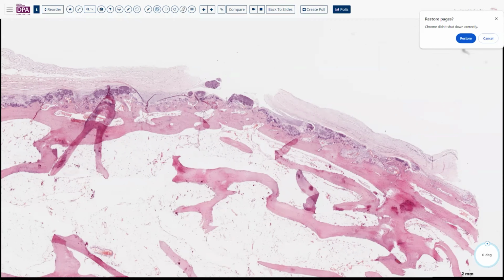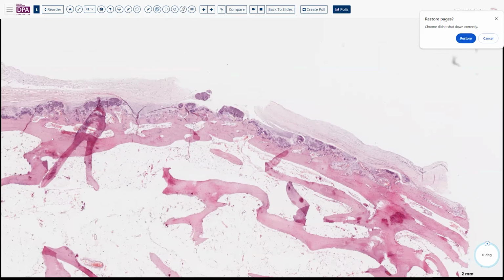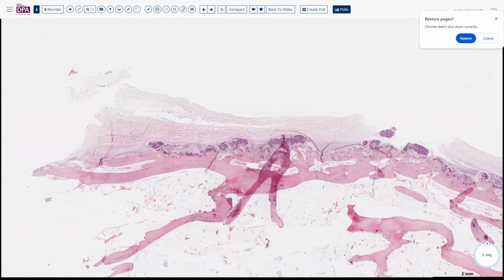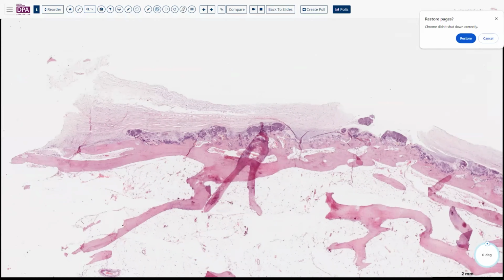But in this case, it's just very gently, very slightly thickening the cortical bone and producing a low level of growth. As these become polypoid or pedunculated and so forth, they become more easily diagnosed radiographically.